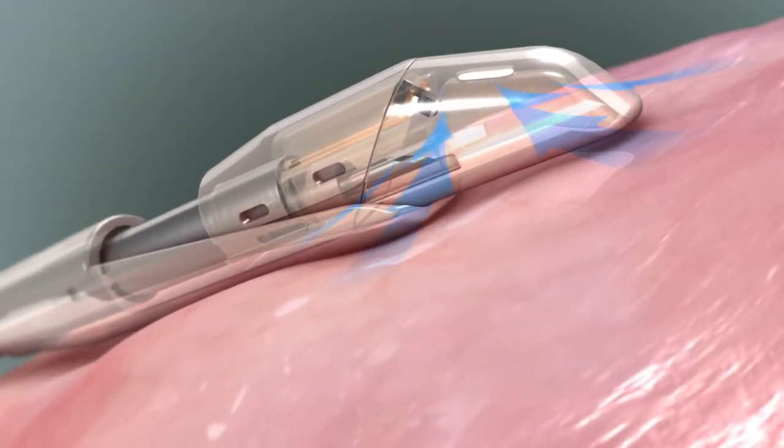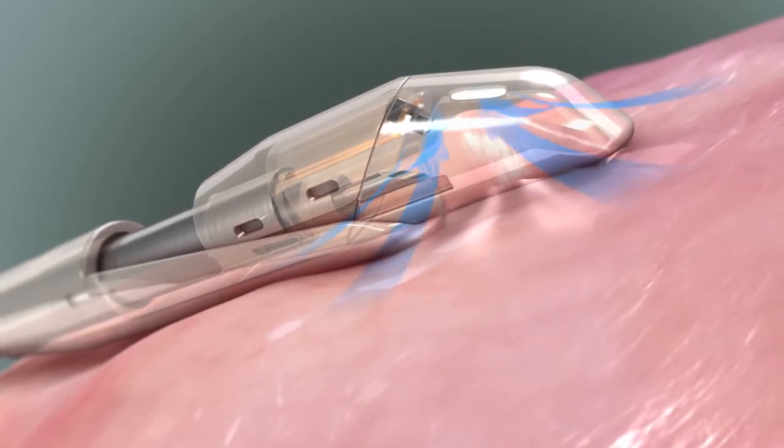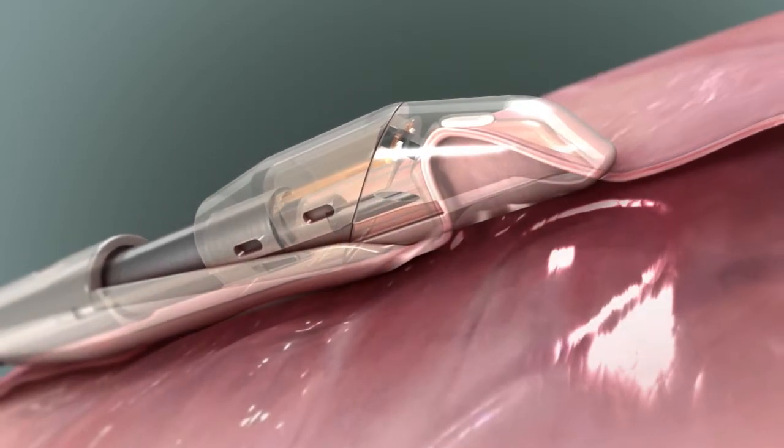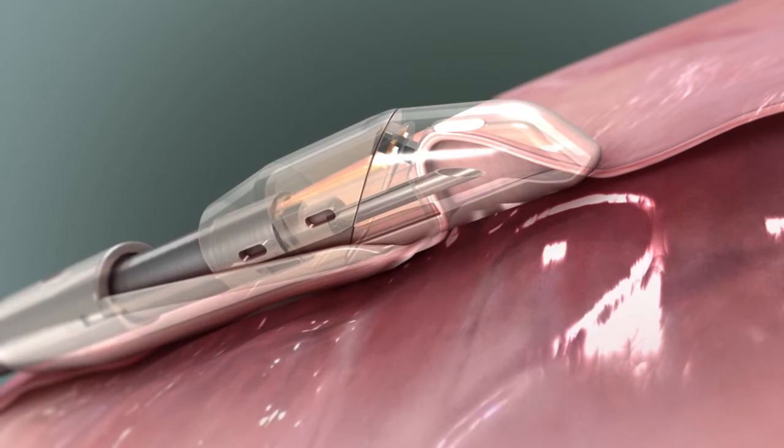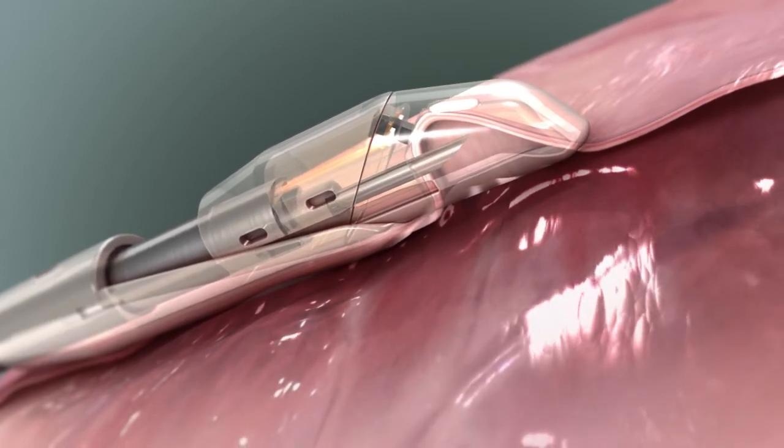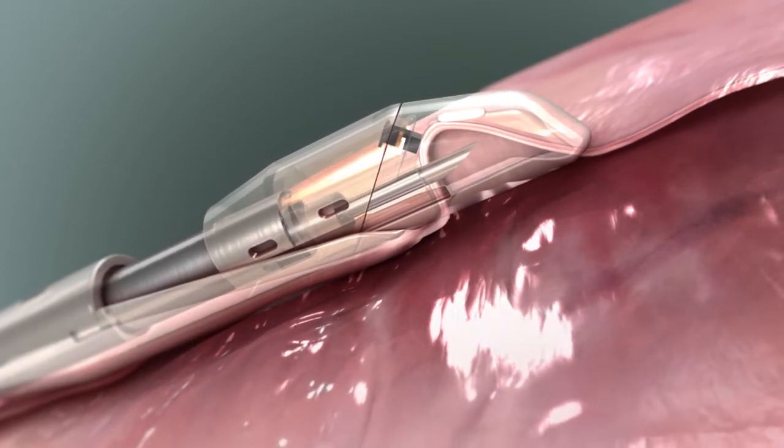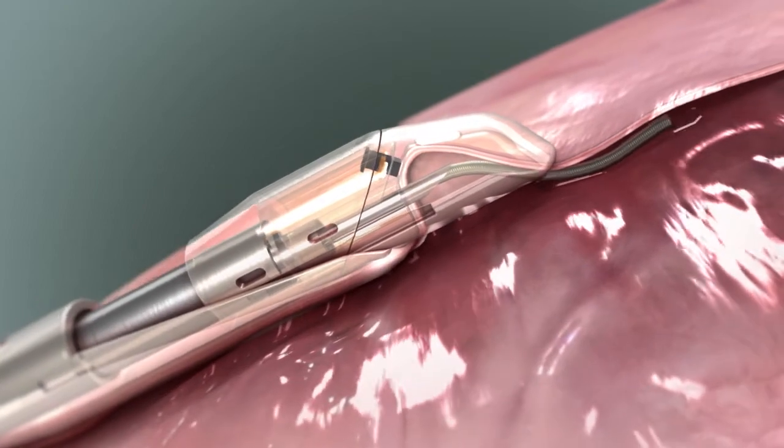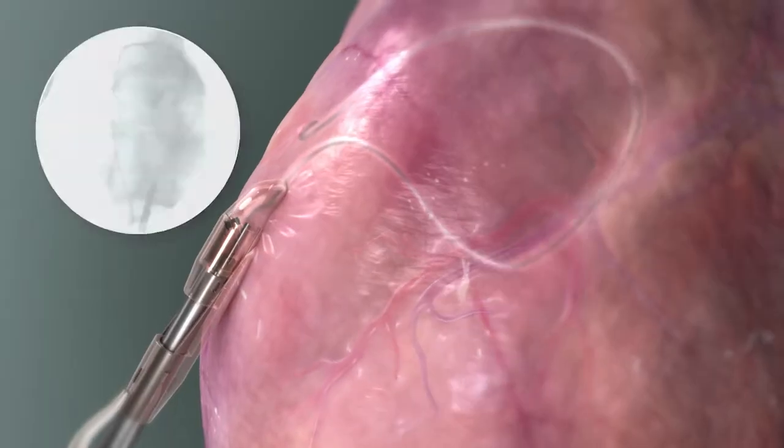Start suction and pull a portion of pericardial tissue into the chamber in the device's tip. Slide the needle forward and puncture the pericardium. Insert the guide wire using fluoroscopy to ensure that the guide wire is in the pericardial space.